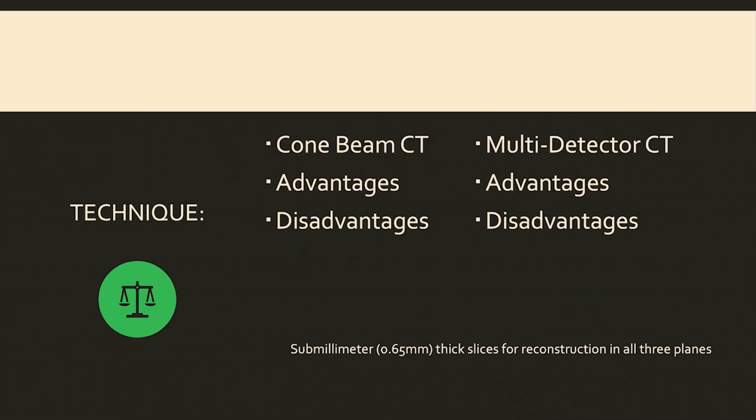How many people have cone beam CT in their practices? Anybody? Okay, none. So this is a very common thing for dental practices and oral surgery. They have them in their office, they're cheap, and they have much lower radiation.